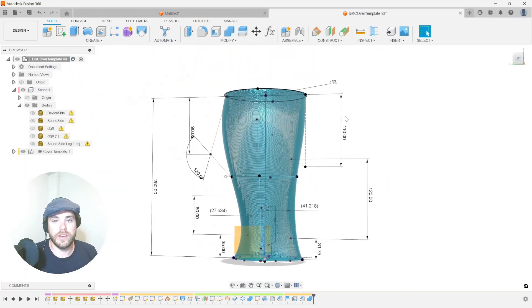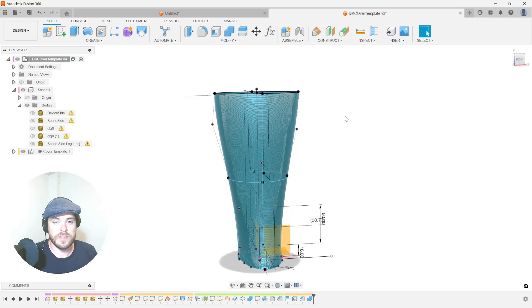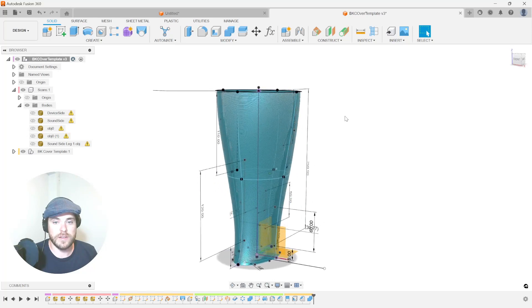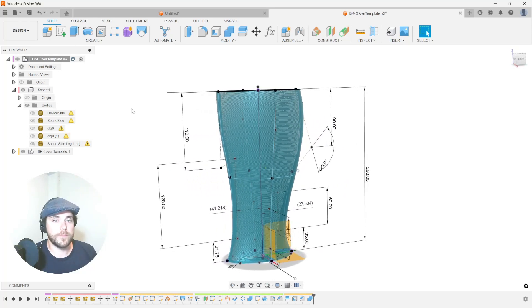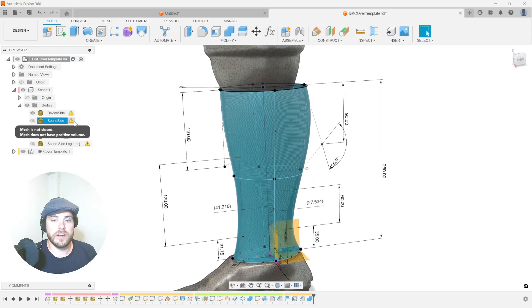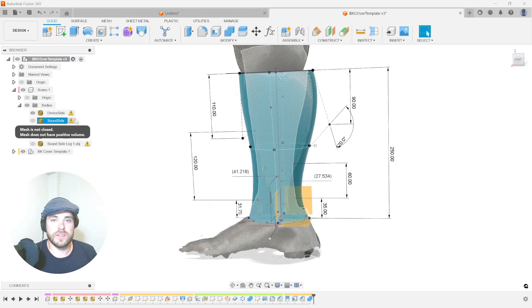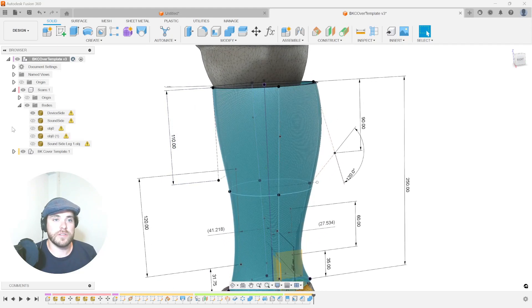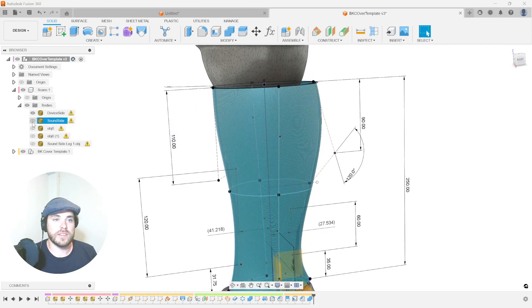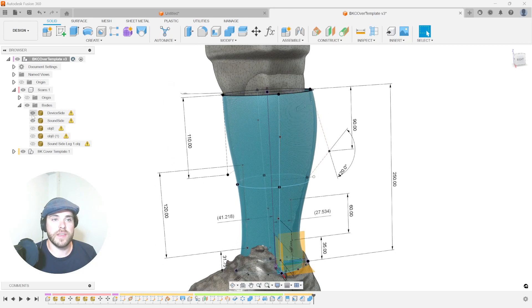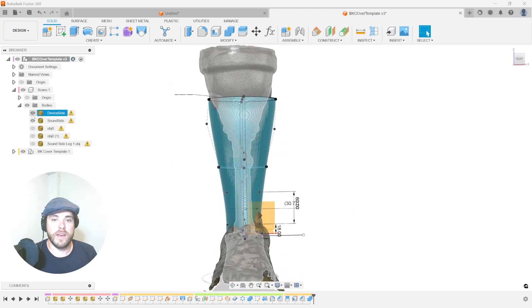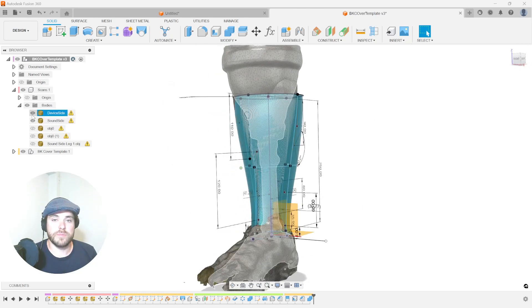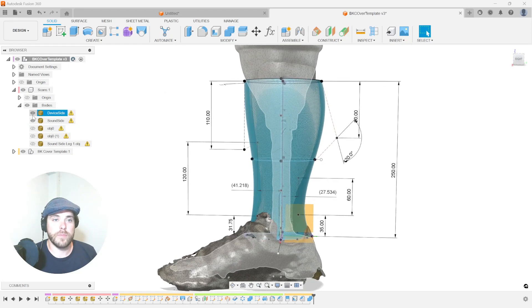This template is ready to go. We just need to be able to recycle this between patients. So what does that look like? We can bring in a new device to this template brought into the origin. We can bring in the scan of the sound side on top of that device, and all we have to do now is bump things around to make these two match.